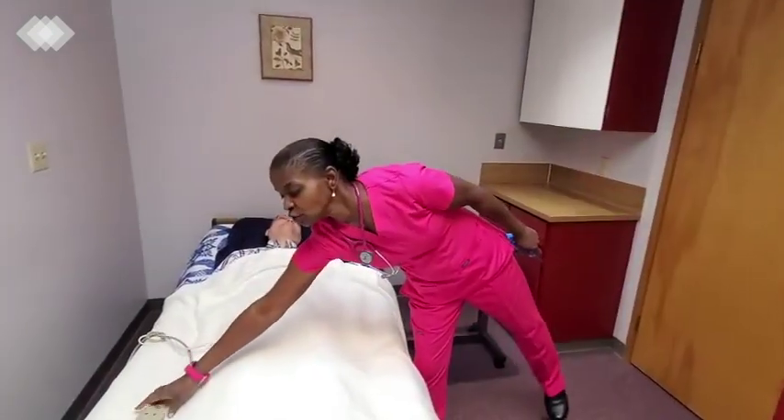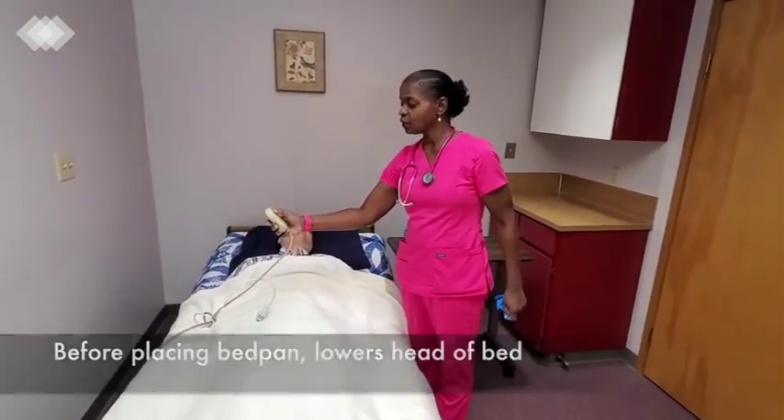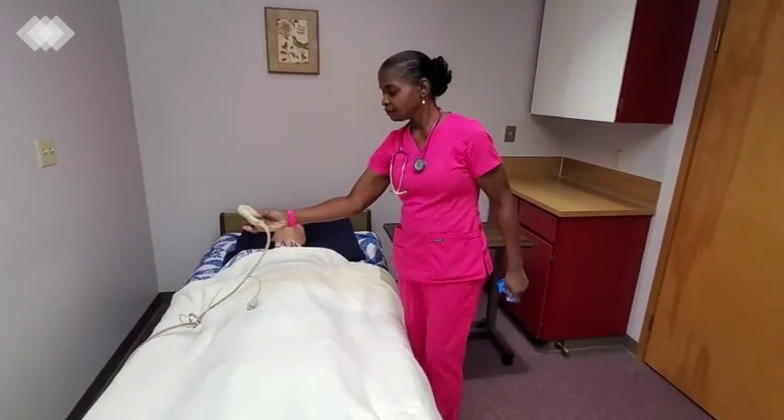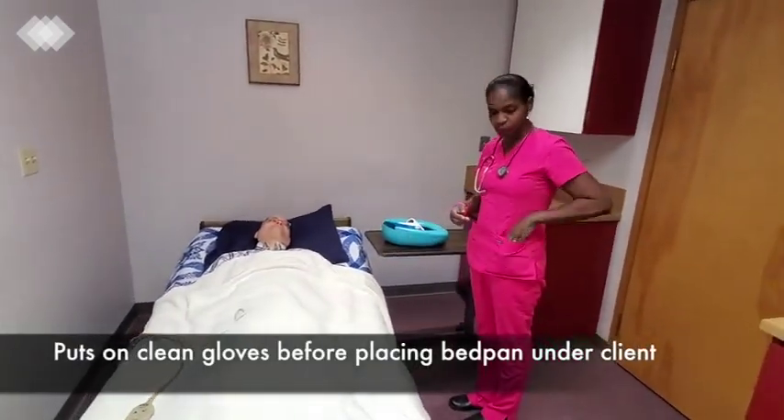I will make sure that his bed head is lowered. Before I put the bedpan under Peter, I will put on my gloves.